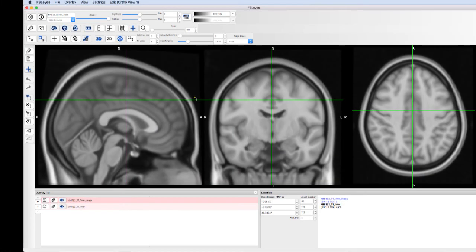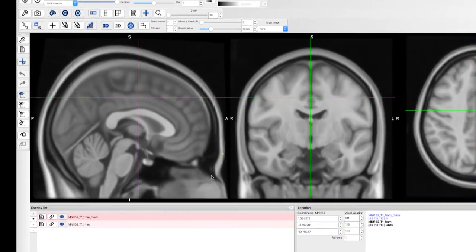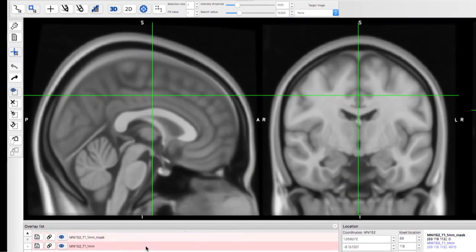One more useful feature is to select based on the intensity of the parent image, for example, selecting white matter voxels.